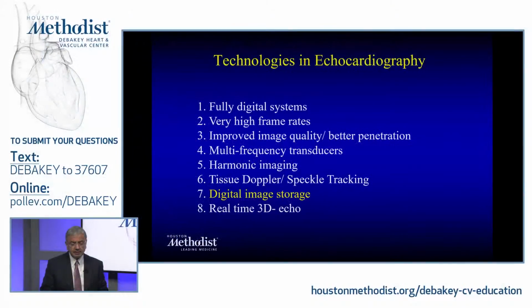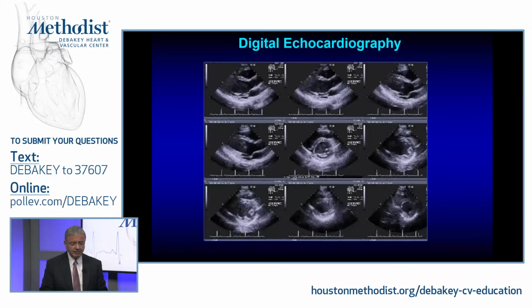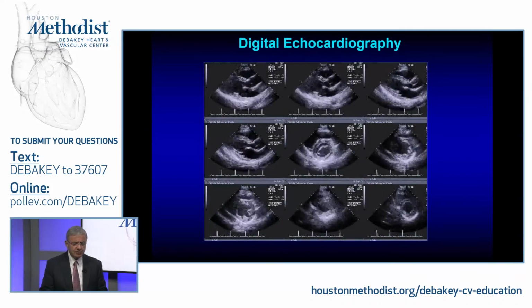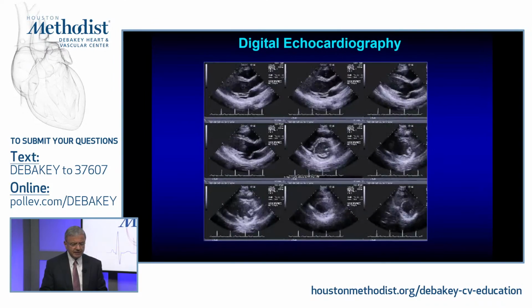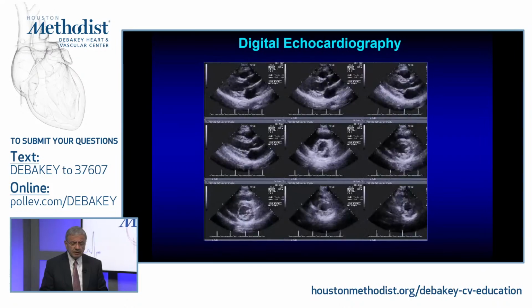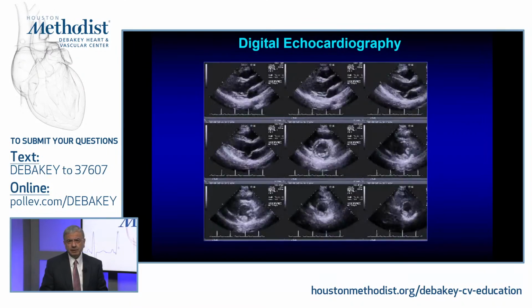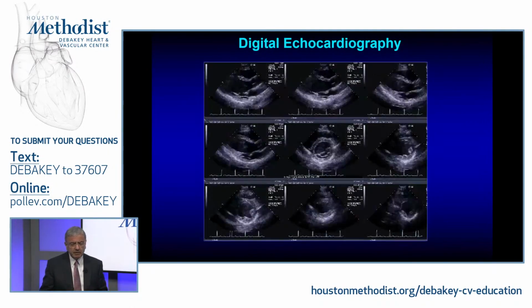Digital storage, I think it's interesting. We take it for granted nowadays, our new trainees. We lived through the days of videotape. We lived through the days of offline digitization. Nowadays, it is so nice to be able to have that, and don't take it for granted. But I want to emphasize one important thing, is since echocardiography is so operator dependent, yes, we have protocols, but we are very operator dependent.